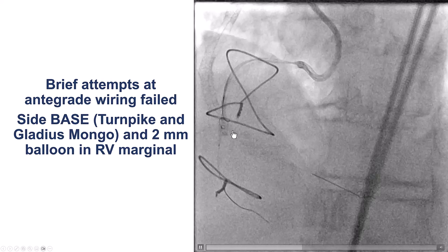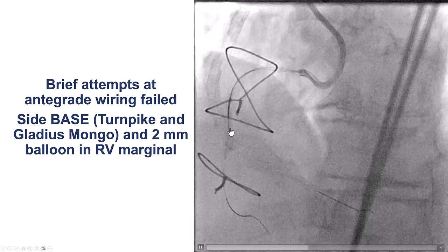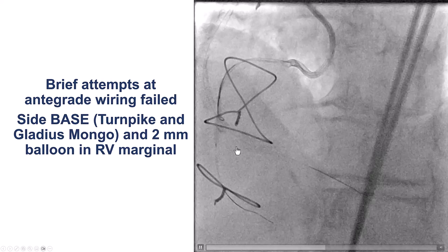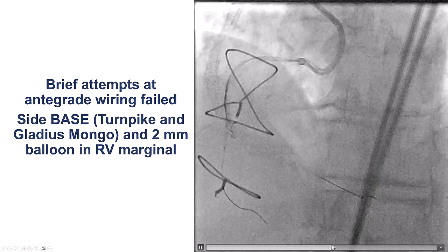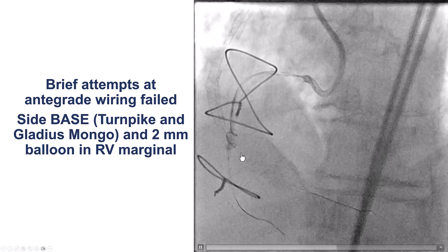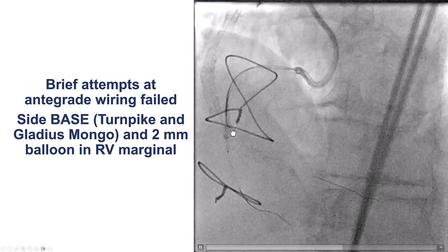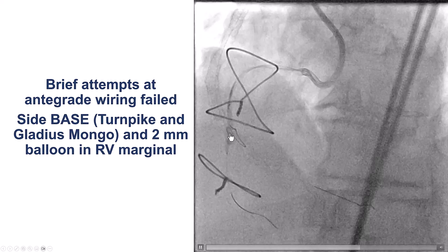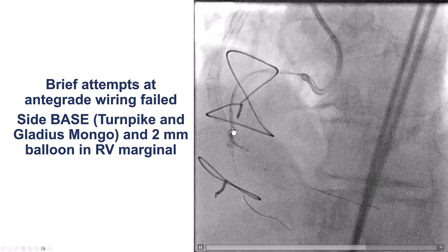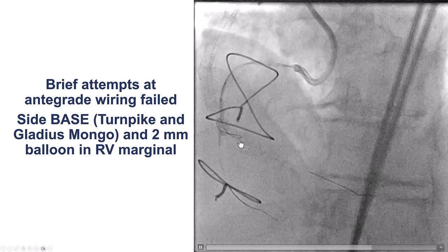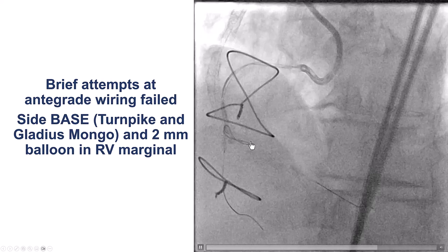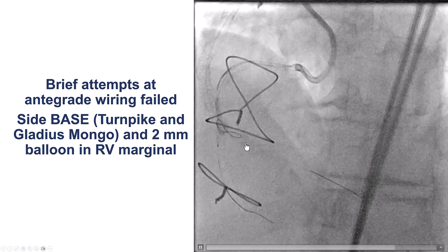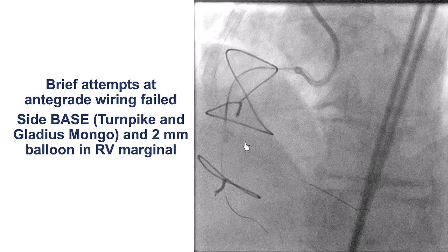This is a Gladius Mongo wire, and the Gladius Mongo could then be redirected to follow the course of the distal RCA. Before doing the side-branch balloon, the wires just kept going inside the marginal branch, but now we have formation of a nice knuckle going along the course of the distal right coronary artery.